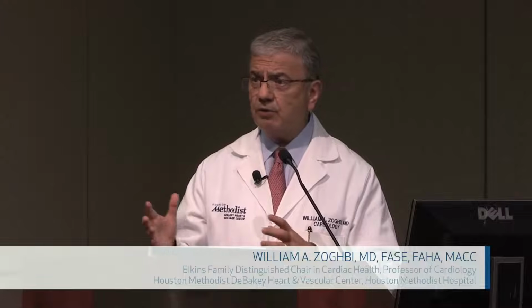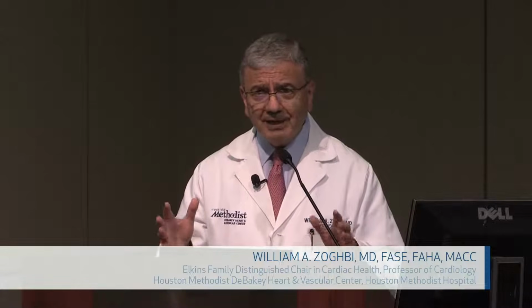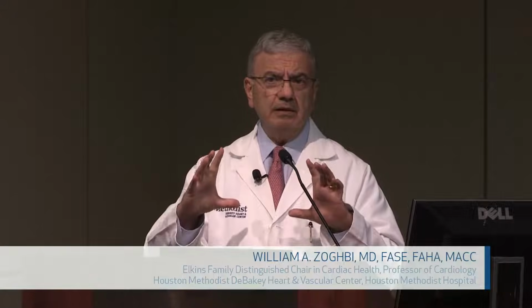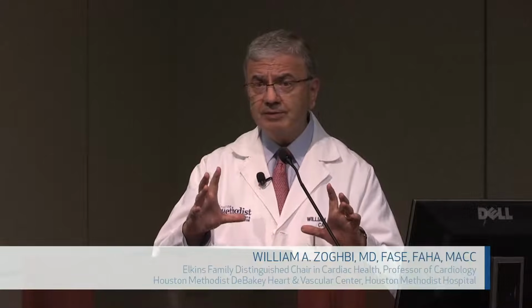So nowadays, most ultrasound machines are preset with contrast settings that decrease the mechanical index and try to optimize them. These are done for 2D, not as well as for 3D, and we've been appealing to industry to make sure that we have some settings for 3D. Yes, you destroy more because in 3D you're sending the ultrasound beam not in a single plane, but in a cone-like situation. So you send a lot of energy and you'll destroy a lot of microbubbles, but I'm pretty sure the engineers will figure something out to enhance the utilization of contrast with 3D echocardiography.